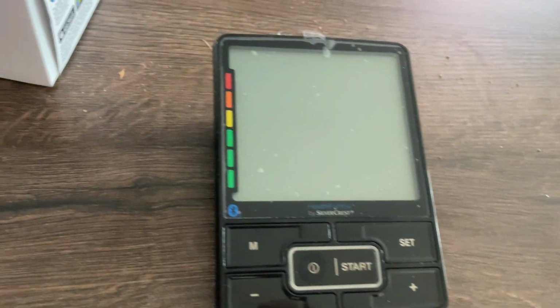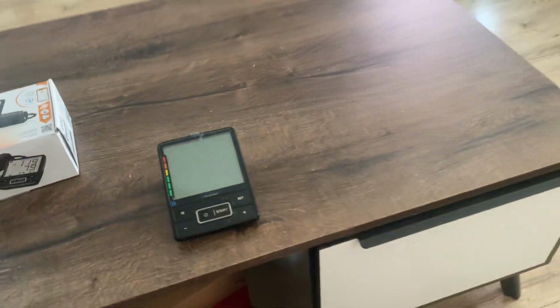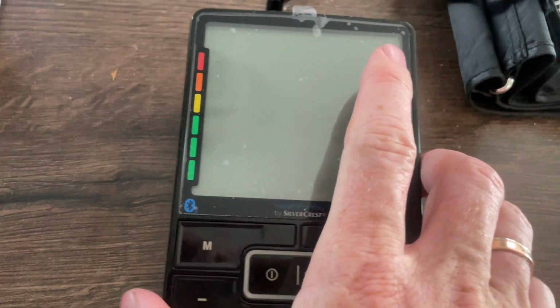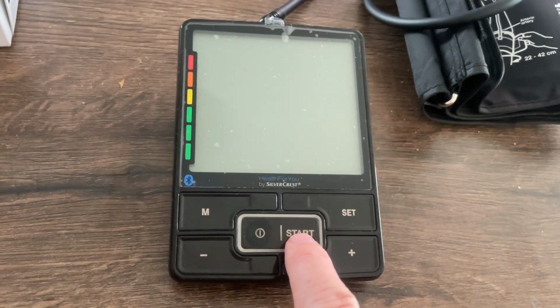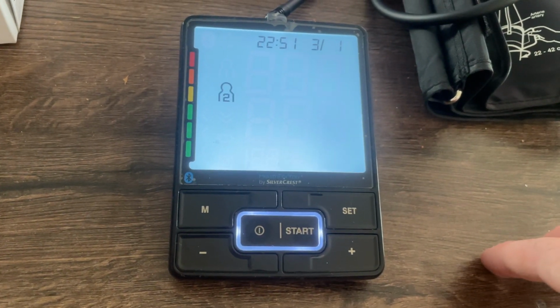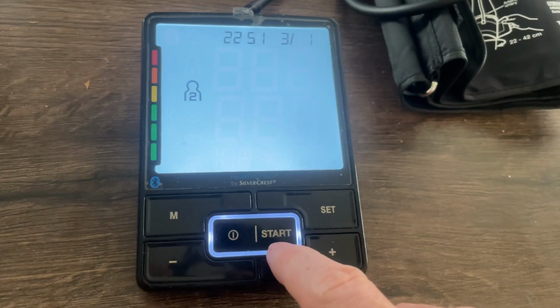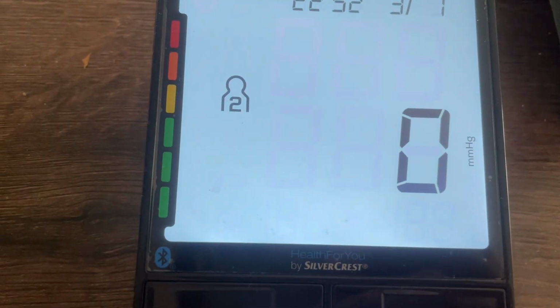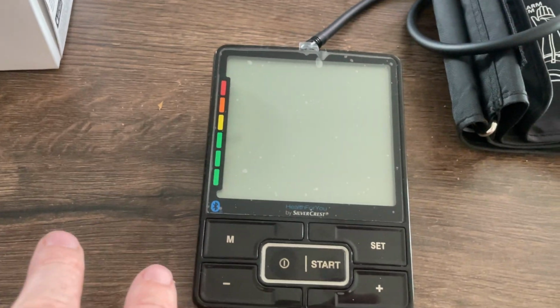I don't want to connect these parts. I just try if we changed the battery in the right way and if the equipment is working correctly. So we can test it with this start, and we can see that everything is ready for using. So the batteries are okay. We can check the information and we can see here the battery was okay. So now it's working, but we don't need to use it. So everything is working correctly.